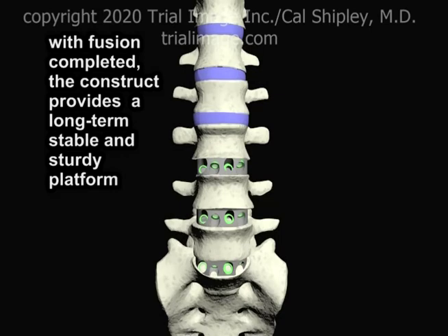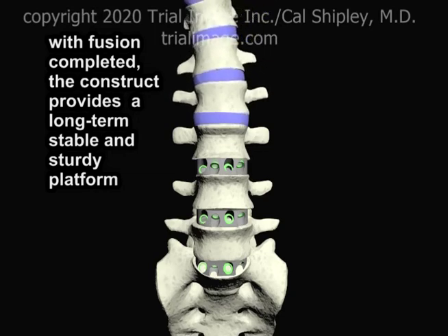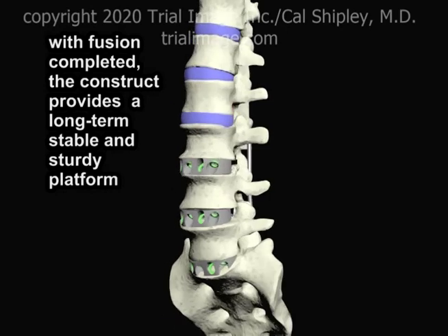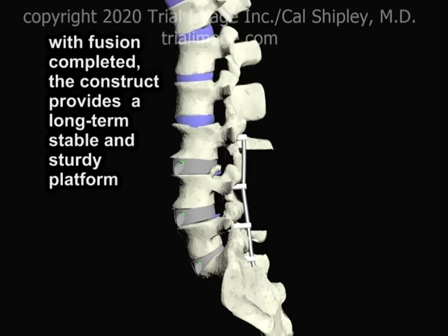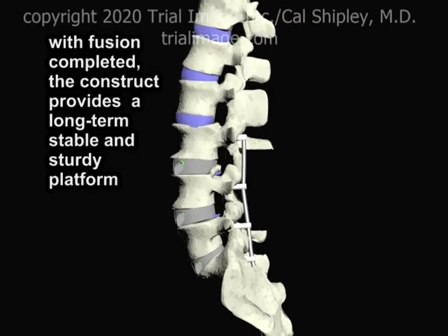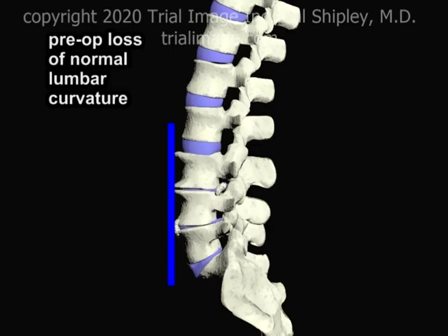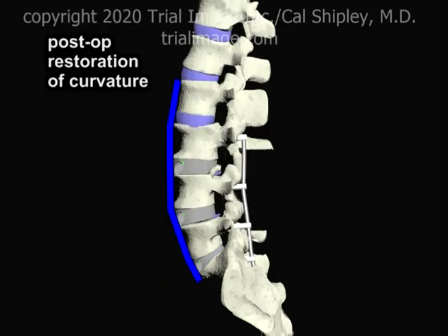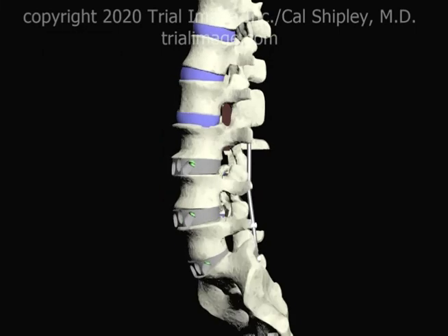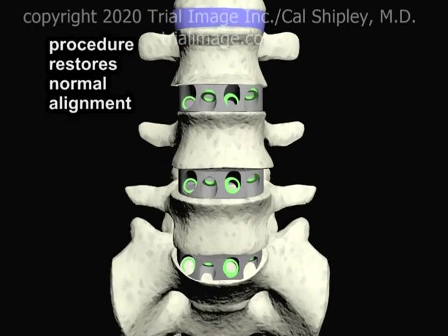Once fusion is complete, the construct provides a stable and sturdy long-term platform. The procedure also restores the normal curvature of the lumbar spine. Normal alignment of the vertebrae is also restored.